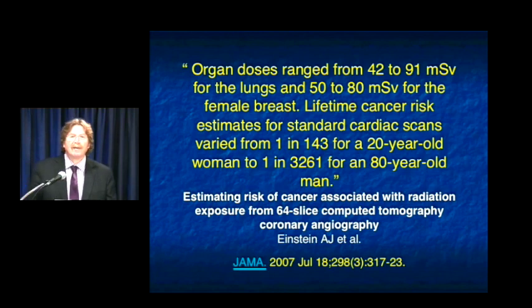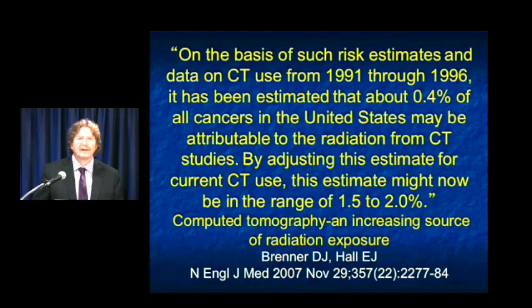It spoke about how a coronary CTA could increase your cancer risk for young patients as well as for old patients. Now, there was nothing looking at the advantages and how it would improve quality of life, but it really focused on this potential for radiation issues, and this was all simulated dose, but nevertheless, that was there.